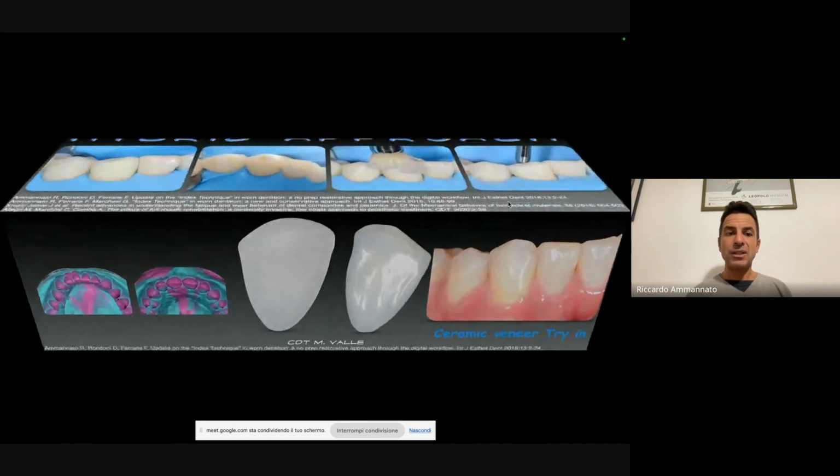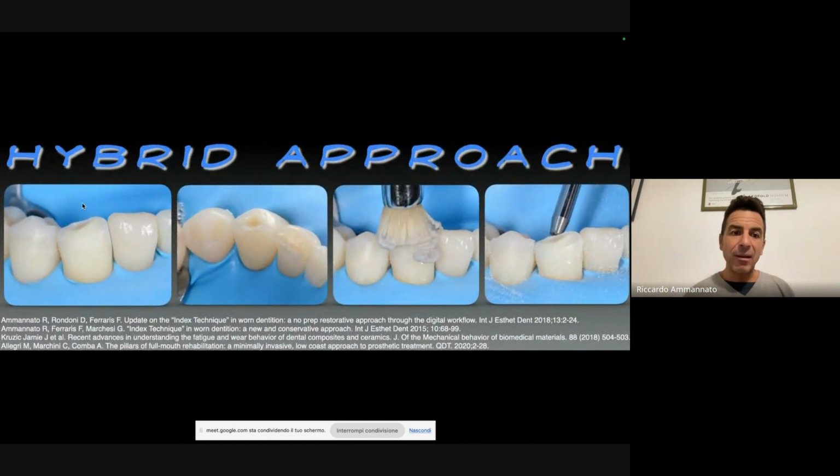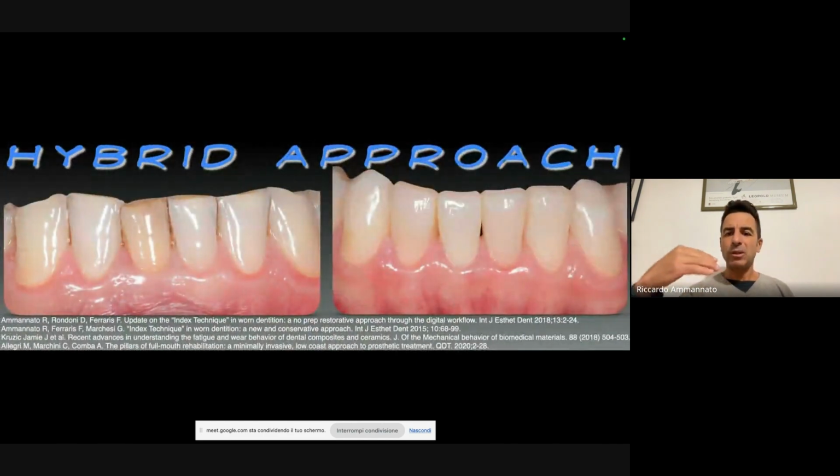So I managed this with just a 45 degrees bevel, as you see here, and you see it also here. This is the only prep that I do on the canines, a 45 degrees bevel. All the rest here in the internal part is going to be a no prep. So since it's a no prep, we need to do a procedure to remove the biofilm, then we do the sandblasting down the enamel, and then we will do the bonding procedure, and then we will go and cement the veneers, okay, the glass ceramic veneers.